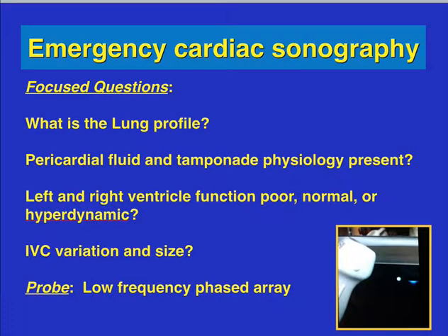So remember, just like any other ultrasound procedure bedside, we have to have focused questions. Remember, we're not doing full cardiac echocardiograms. This is just a bedside procedure to help us make a decision that will make an immediate impact on the patient. So the focus questions that we have is, what is the lung profile?